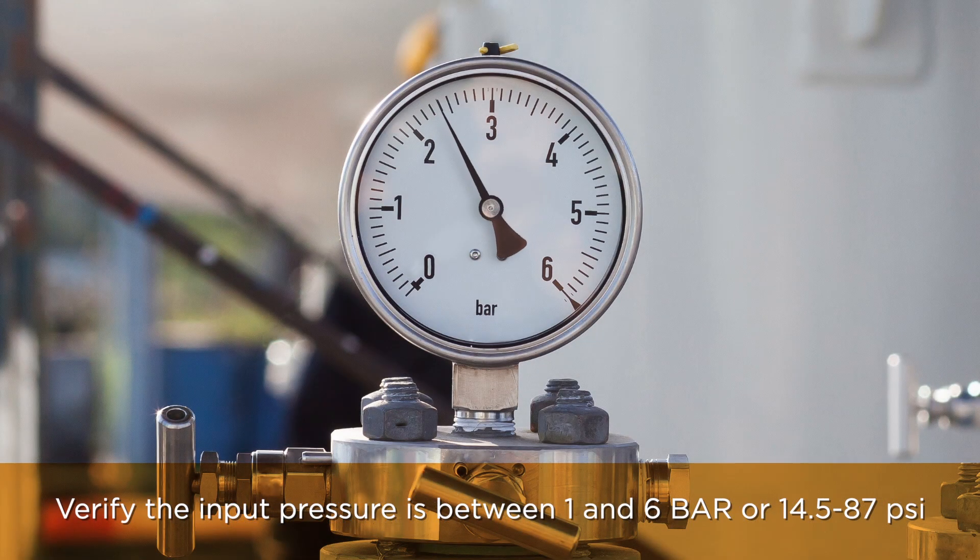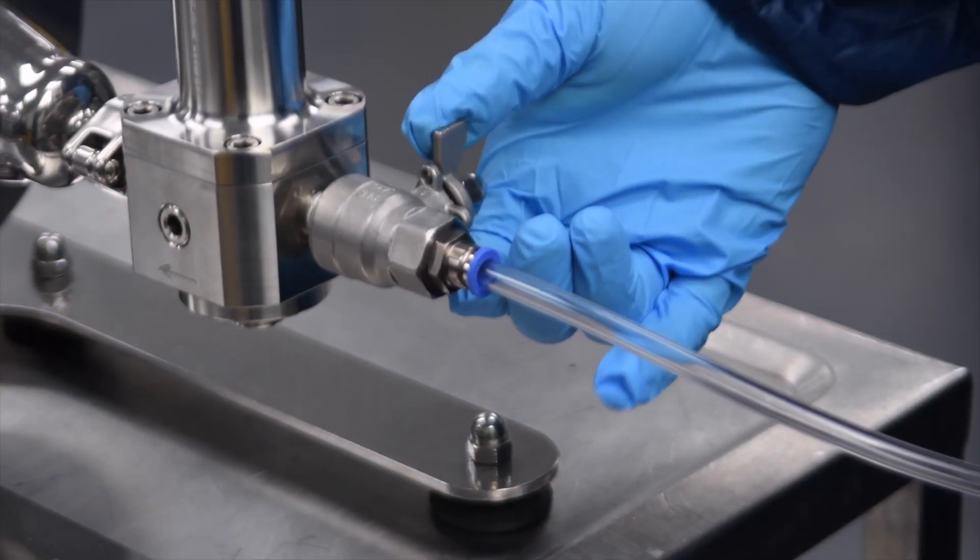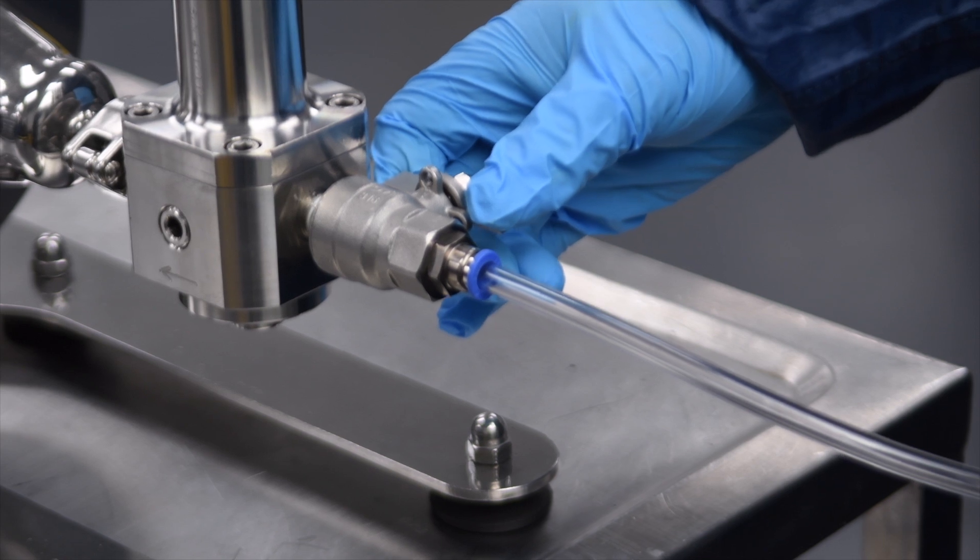Verify the input pressure is between 1 and 6 bar, or 14.5 to 87 psi. Open the gas valve for a few seconds to perform a circuit cleaning.